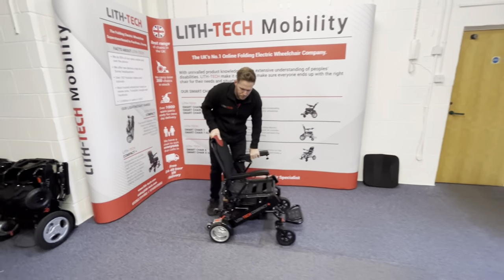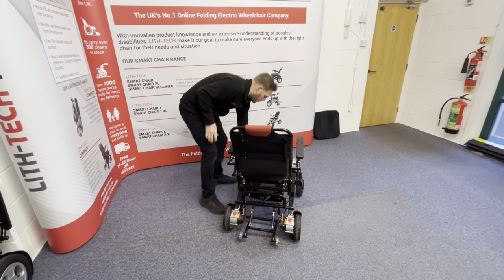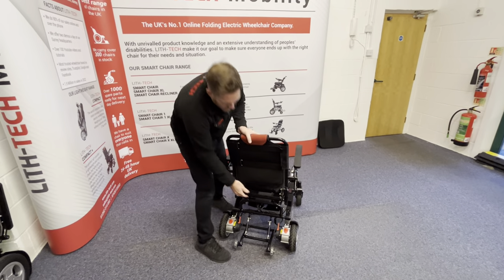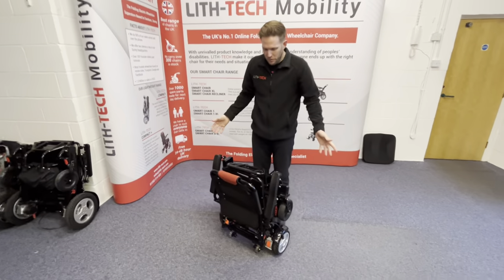To fold this chair, we've got a little bar at the back — let me swing it around a bit. First of all, you're going to line your wheels up so they're facing forward, press down the bar, and then just bring your hands back. That's your folding position.